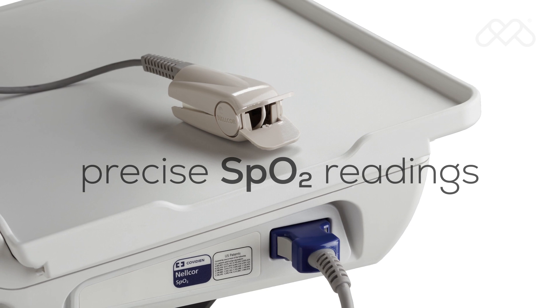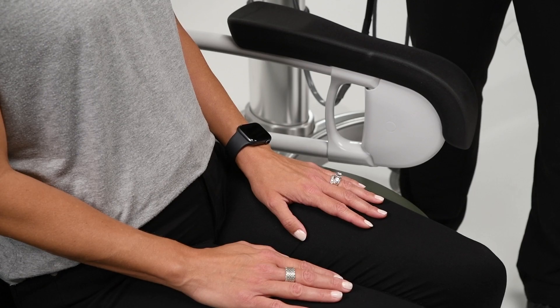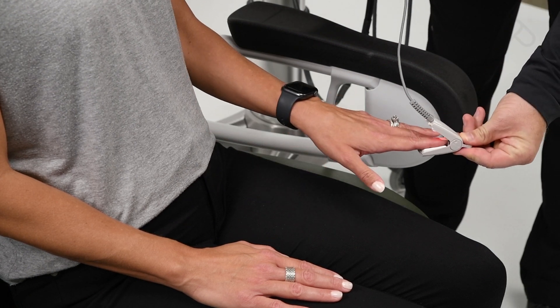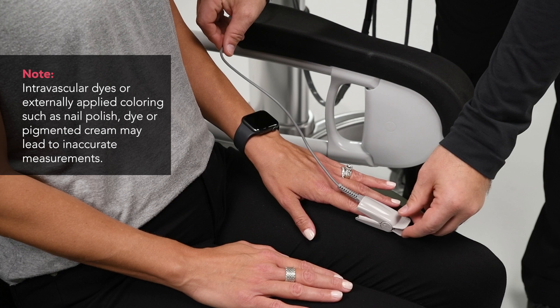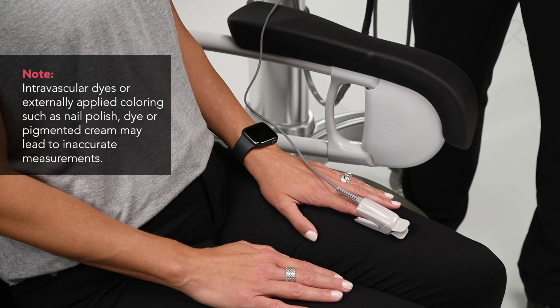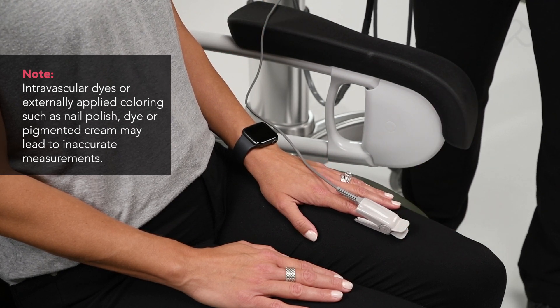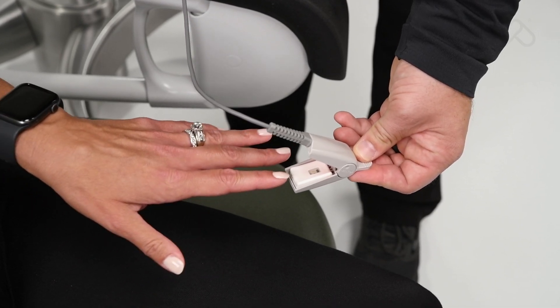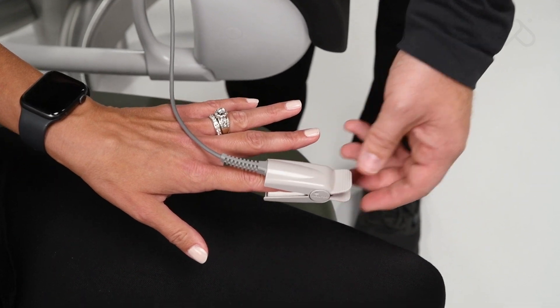Nellcor OxiMax SpO2: Nellcor OxiMax technology delivers continuous monitoring with precise SpO2 readings, even for patients with weak pulse signals or fragile skin. To apply the Nellcor SpO2 sensor, first place an index finger over the sensor window with the fingertip against the stop. If the fingernail is long, the nail tip will extend over the finger stop. Spread open the rear tabs of the sensor to provide even force over the length of the pads.